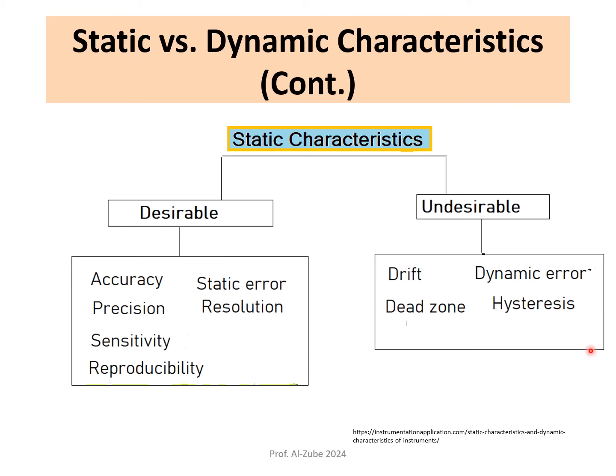And then we have something called dead zone, and that's another thing that is undesirable in medical instruments. The dead zone is the range of values that the instrument cannot detect. It is typically a low amplitude range in which the instrument sensitivity is not sufficient to detect a signal or make a meaningful measurement for us.